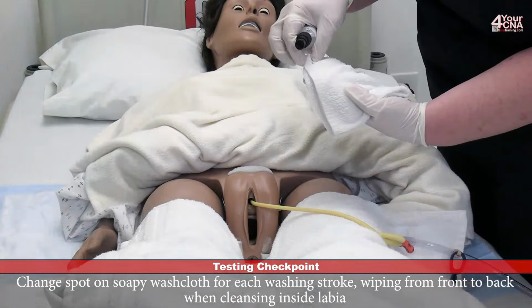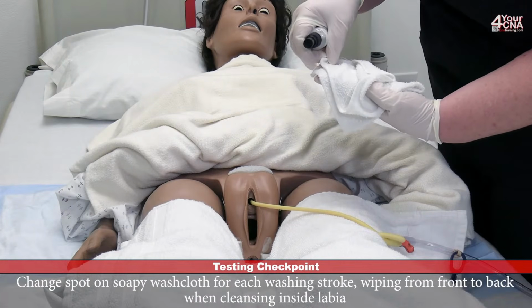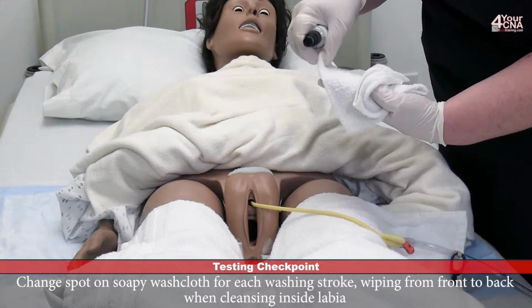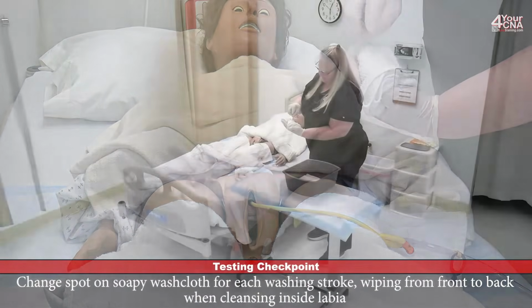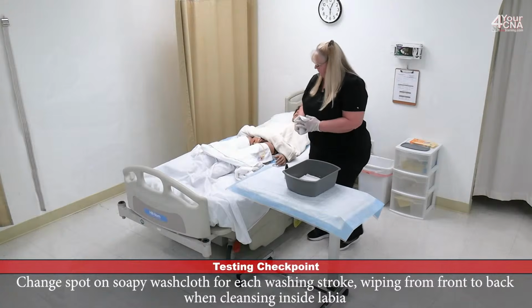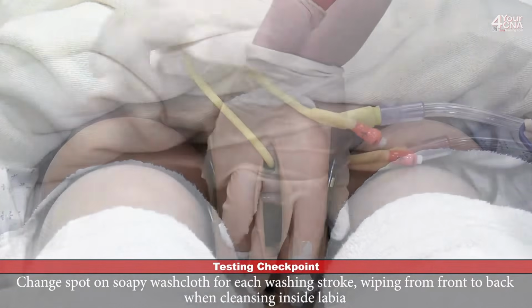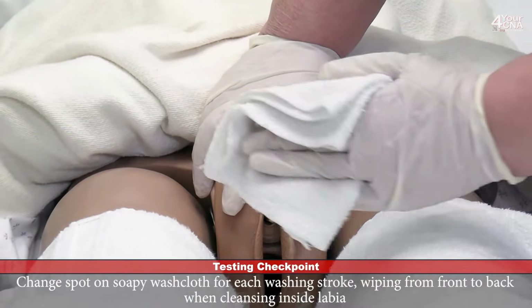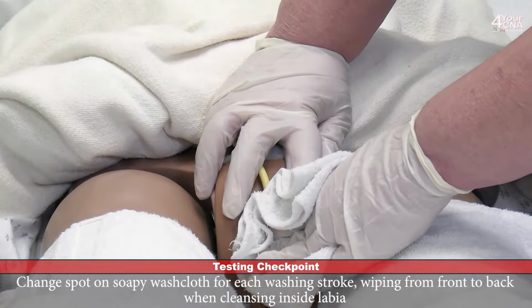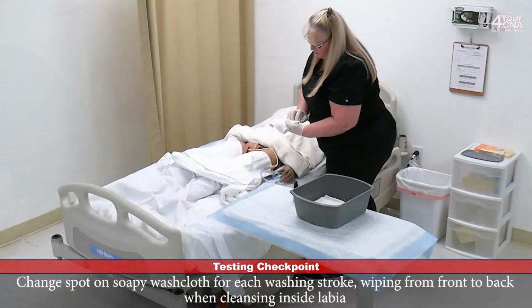1, 2, 3, 4, 5. I'm going to hold the catheter out of the way, retract her labia, and then wipe down the center, top to bottom, and then move away and fold that leaf.